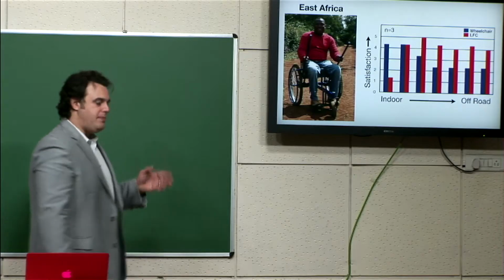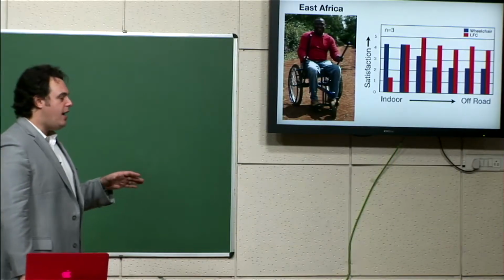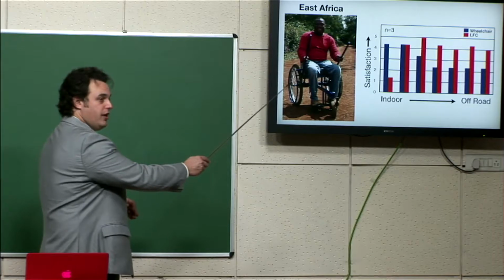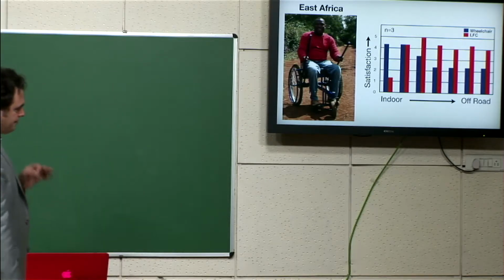And we had 6 people in this trial, 3 of whom were full-time wheelchair users. And we realized that was really our target market, whose needs were underserved. People who ride hand-powered tricycles in a city, and let's say they had polio, and they can move around on crutches for short distances, but they just need their tricycle to go long distances. That product works pretty well for them. But the people who were underserved were people like this guy who had a spinal cord injury and had to go longer distances on rougher terrain. So I'm showing you data from those 3 full-time wheelchair users here.